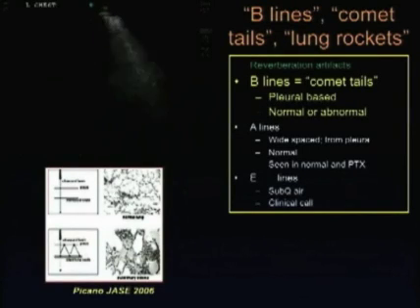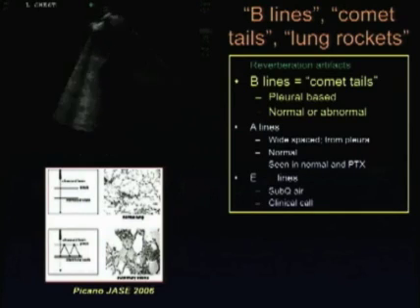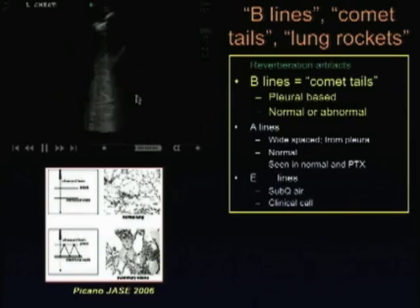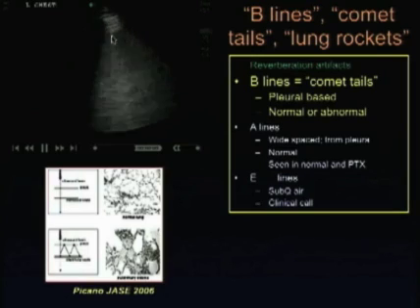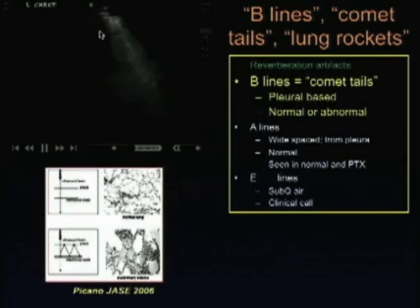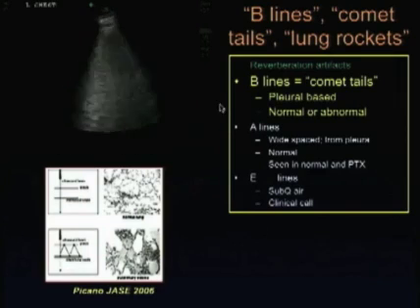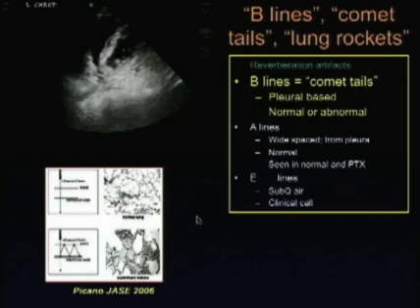So starting first of all with the first component of this, the interstitial edema. Here is an image that shows intensive B-lines culminating actually in an area which is showing a large pleural effusion at the end of the clip here. But in the meantime, there are intense B-lines apparent, or comet tails arising from the pleural line here. There's also been A-lines described, E-lines and Z-lines, which we will not be dwelling on today.